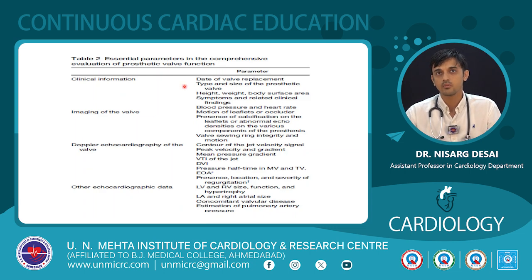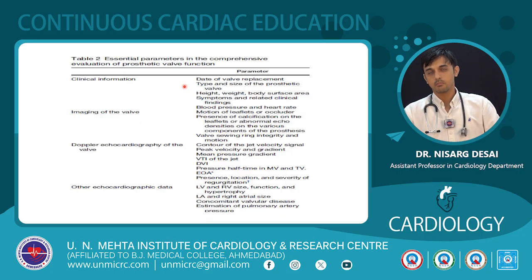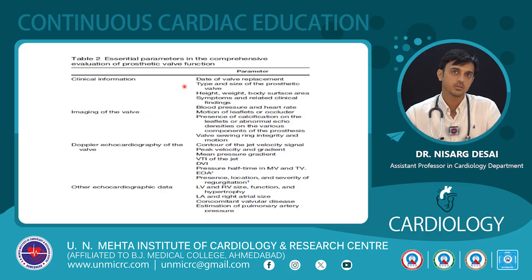So what is the date of valve replacement? As we will study in the future slides, when we are not sure clinically or echocardiographically whether there is pannus or a thrombus, then the date of valve replacement matters. Usually pannus is seen some years after, so it's a degenerative process, whereas the thrombus is usually an early presentation.